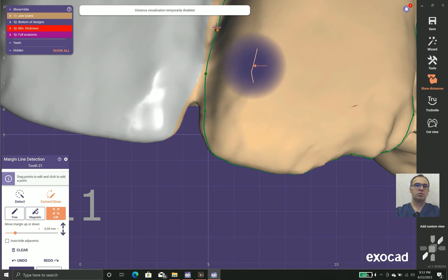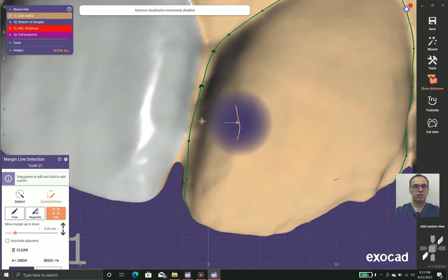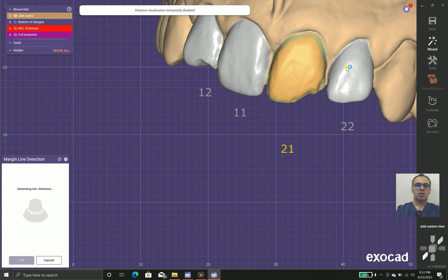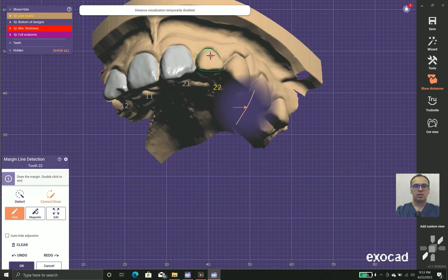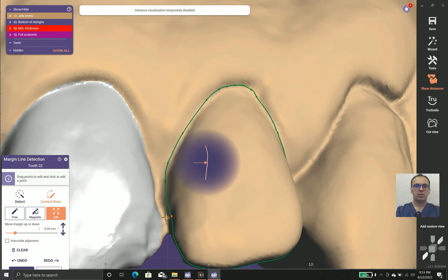We have two different methods of changing the margins: Edit, as you can see here, and Create Line, as seen before on tool number one and two. We change the margins to get better results.